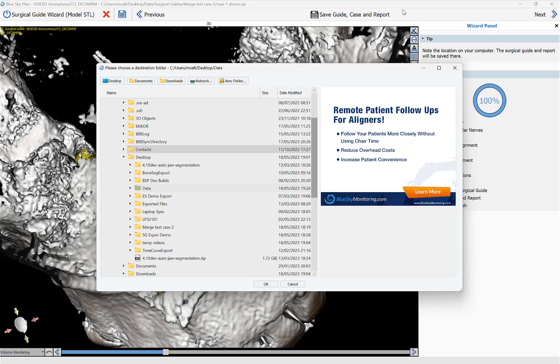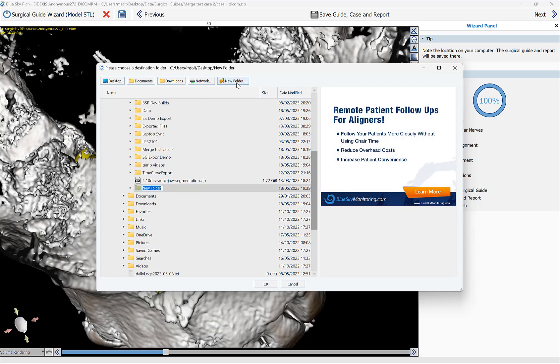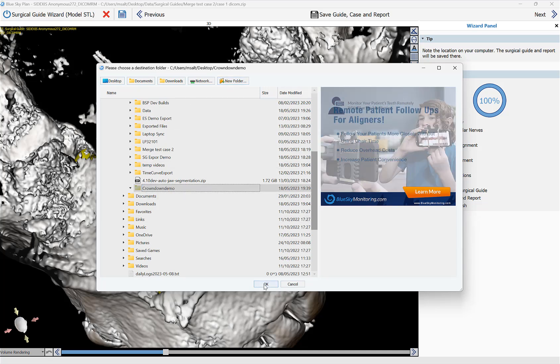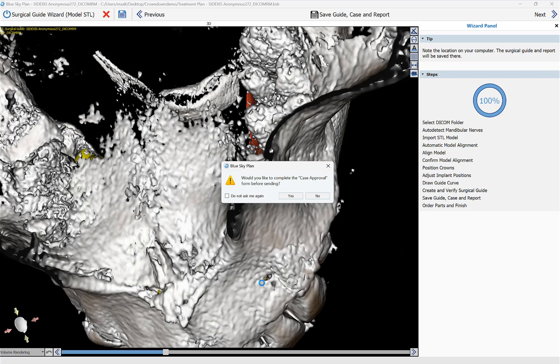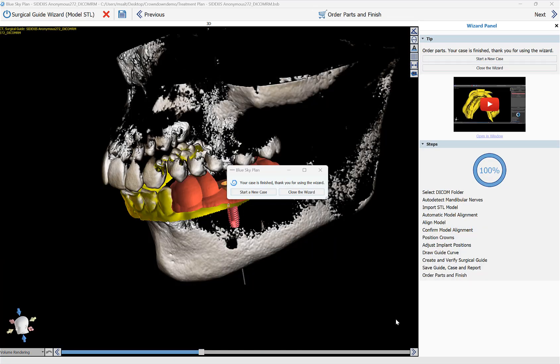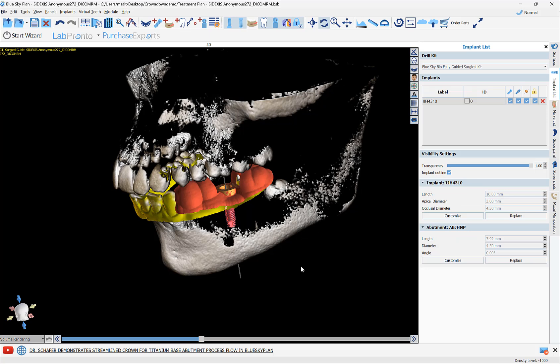We're now going to create a folder to save the relevant data. I'll go to the desktop, click New Folder, name it 'crown down demo,' and click OK. The software saves the project file as well as the surgical guide to that folder. A dialog asks whether we'd like to complete the case approval form before sending — we're not sending this case anywhere for this tutorial, so I'll click No. We have now completed the wizard process flow: loaded the data, placed the implant, and created the surgical guide. Click Close Wizard to proceed to creating the crown for the titanium base for an immediate load case.